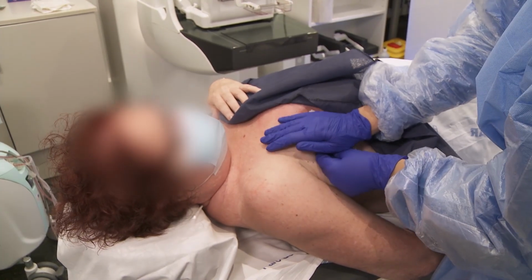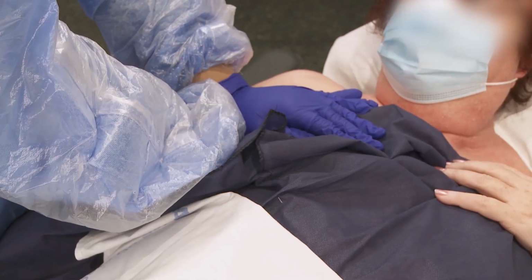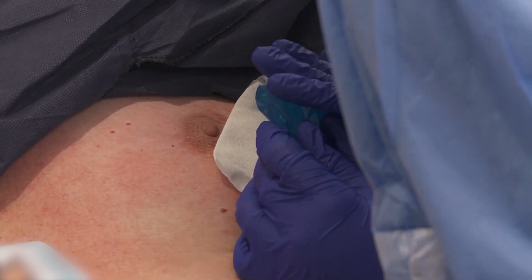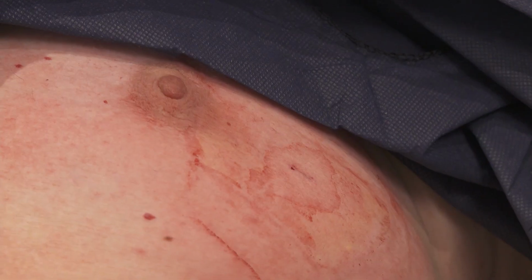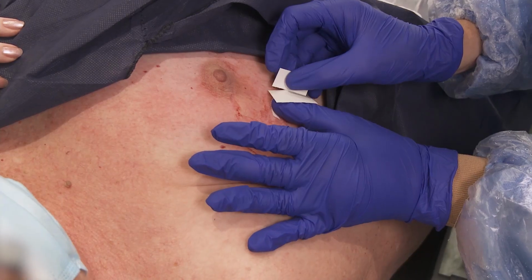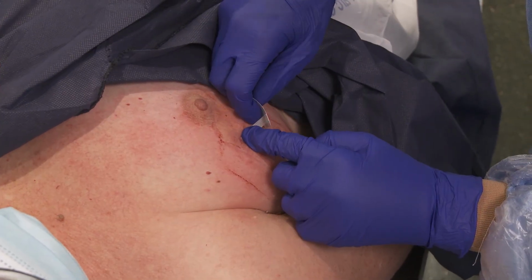Compression is applied in the biopsy area. The entry point is covered with a gauze and an ice bag to continue compressing. Wound closure strips are used, and a compression bandage is added that will remain in place for 24 hours.